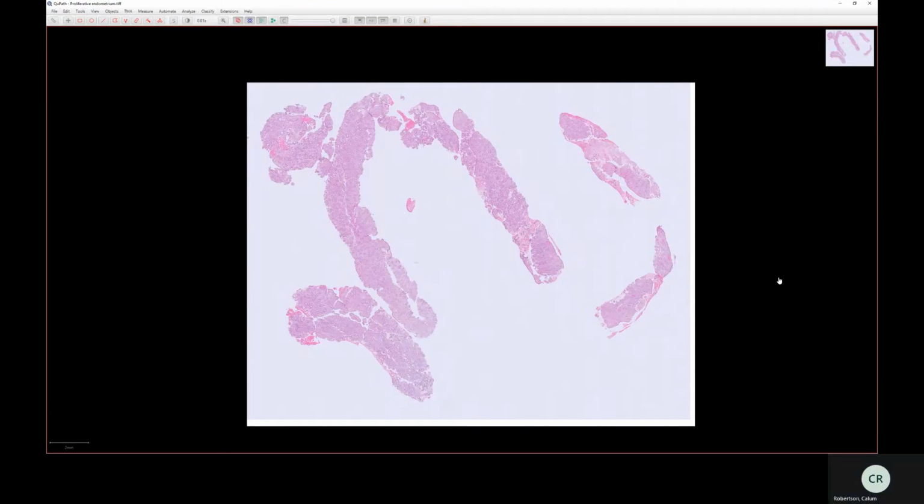In the next three videos we're going to look at the three phases of the menstrual cycle. The first one I'm going to look at is the proliferative phase. The next, we're going to look at the secretory phase, and we're going to finish with the shedding or menstrual phase. So this is the proliferative phase, which happens on approximately day 6 to 13 of the ovarian cycle.